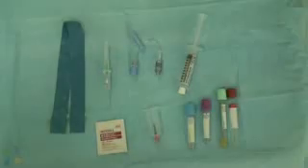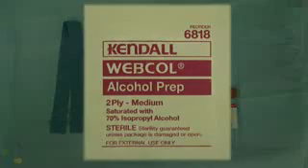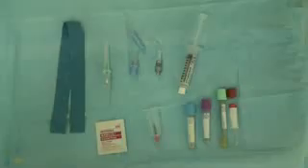Before starting your IV, collect all the supplies you will need. This will include the needle and catheter, a tourniquet, a saline lock and saline flush, antiseptic swab, blood transfer device, and blood tubes.